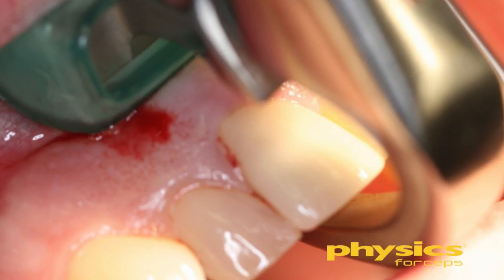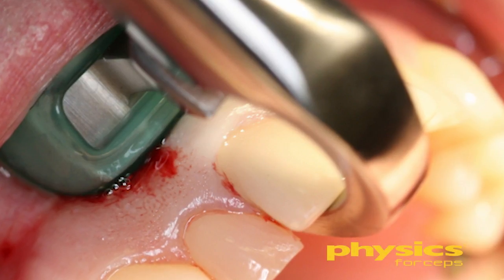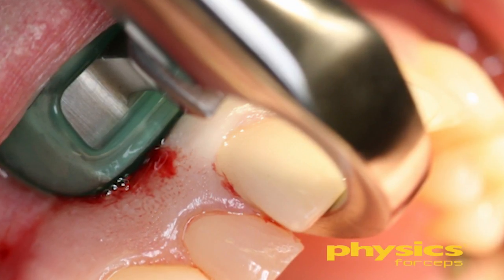You can see there's something green — that's a silicone bumper. It's disposable, one-time use, and it cushions the area. We are not going to damage the facial tissue because we're not squeezing the instrument. The working part of the instrument is the beak, which is a lever that will disengage the tooth out of the socket. We're simply putting pressure — in this situation, I'm using rotational pressure.